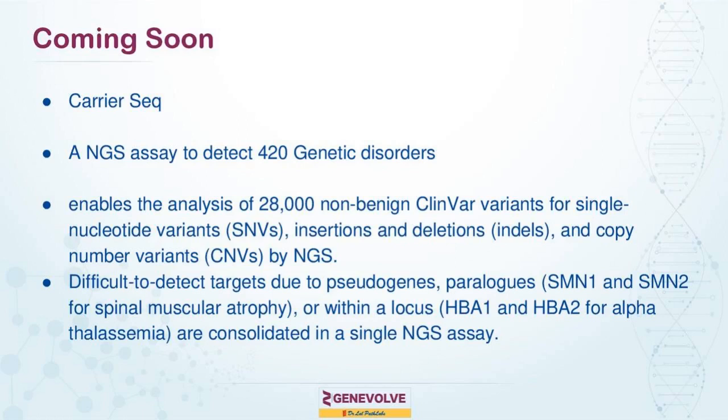Currently, what we are using in our lab is an MLPA-based approach, but that is not a very confirmatory kind of thing, because MLPA does tend to miss certain of these, alpha thalassemia particularly. So we are thinking of graduating to a carrier-seq based assay.